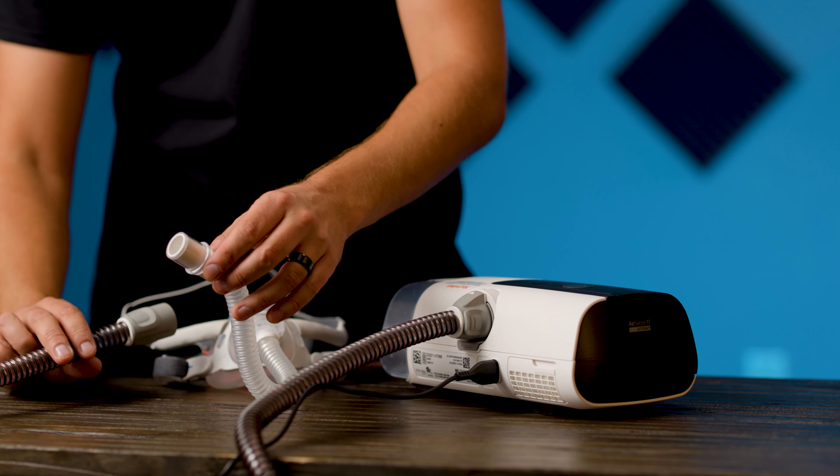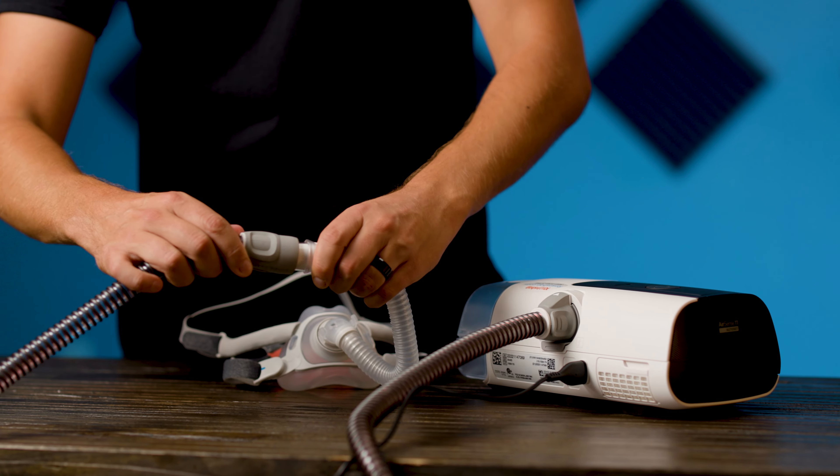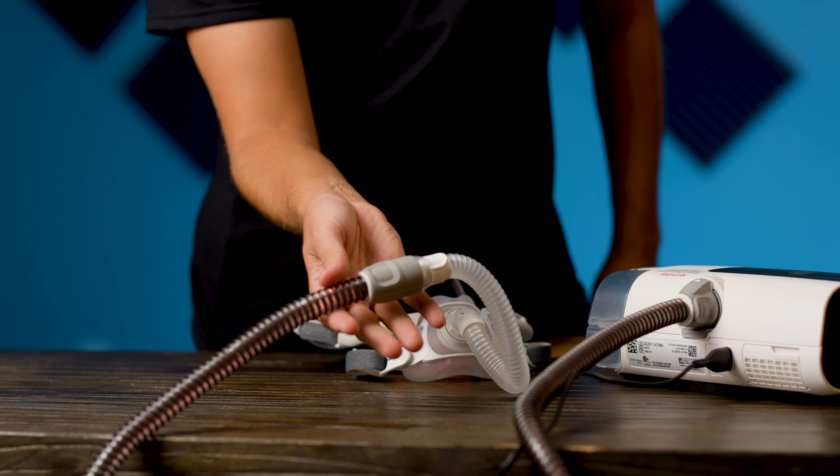The other end of the tubing needs to be attached to your mask. You can either do this now or later when you're ready to sleep, but the process is quite simple. The tubing will attach either to the mask itself or to a short tube that comes from the mask. The exact method will depend on the mask you're using, but it should be straightforward.